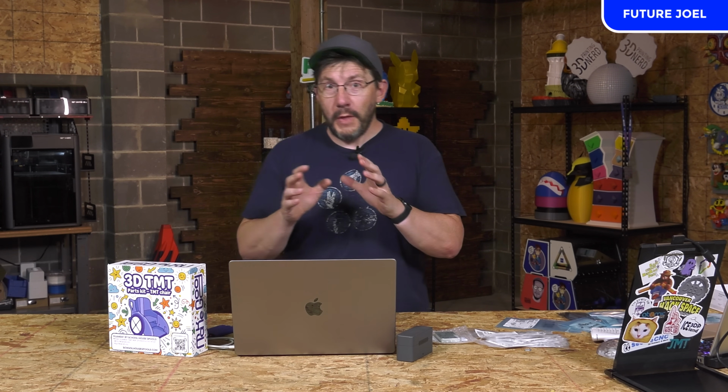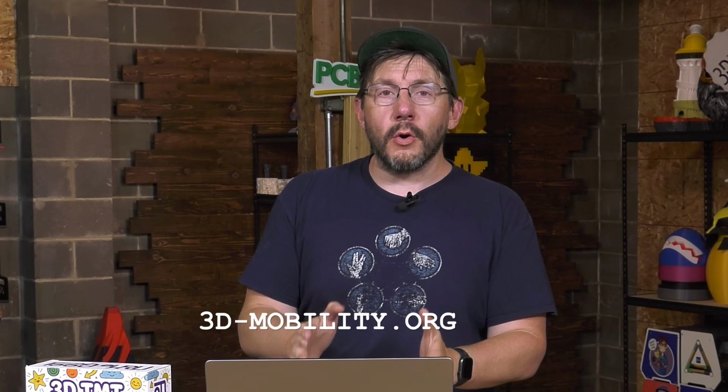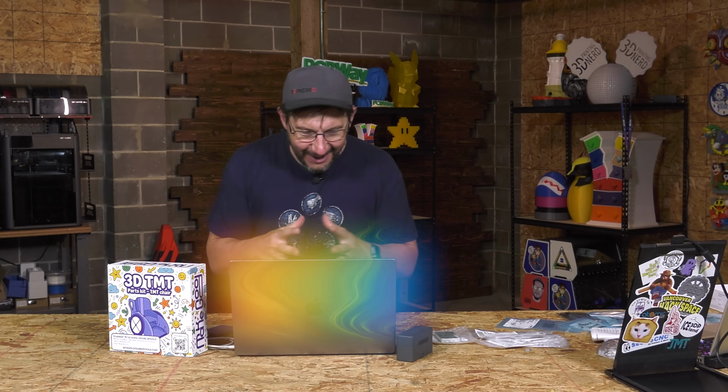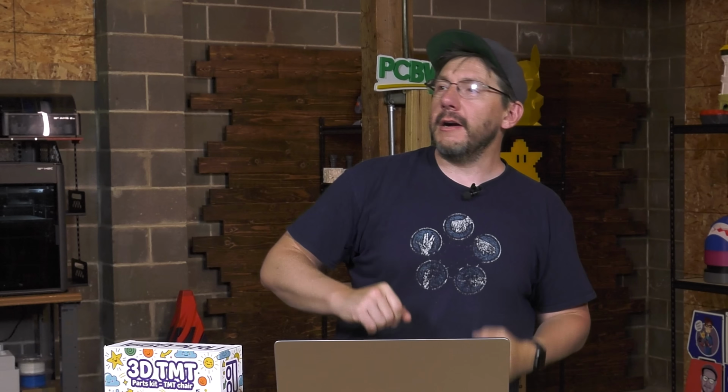Hey, future Joel here. Something happened that was incredible between the time that we finished filming and now, and I wanted to make sure I made you aware of it because at 3d-mobility.org, there is now a color configurator. That was something that I talked to Noam over at MakeGood about very early on, and he was like, yo, dude, I got you. It's in progress. It has dropped.